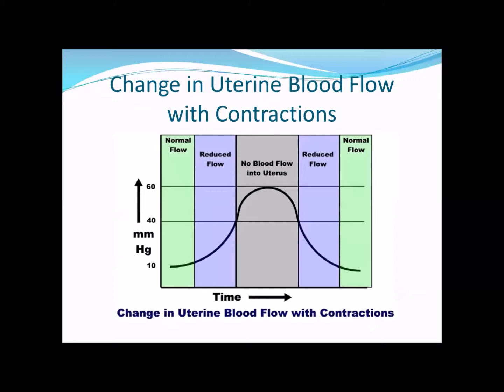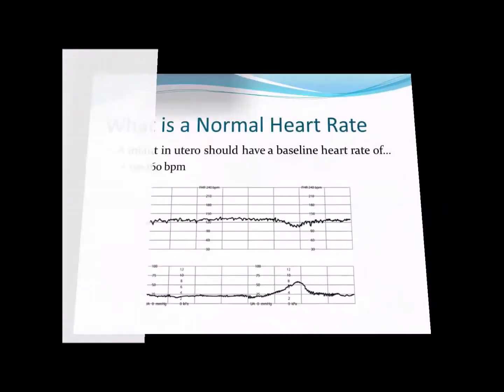When we talk about uterine contractions, when we're looking at a contraction pattern, we count contractions over a 10-minute window, or average it over 30 minutes. I actually teach prenatal classes, and I like to talk to moms about their contractions as a rolling hill. You get to a peak and it should get better, it should not get worse. If they're telling me about a constant pain, I'm really not concerned about contractions at that point. I have other concerns. Contractions should always be coming and going. It shouldn't stay with contraction pain.